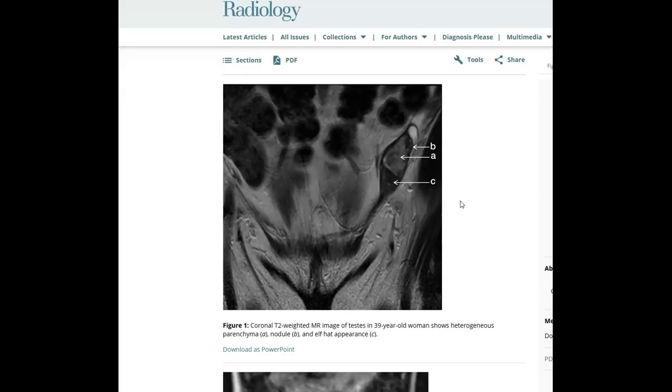Regardless, the treatment of choice is prophylactic gonadectomy after puberty is attained. MR can still be done just to see if something major is going wrong, but MR cannot differentiate between benign and malignant tumors.